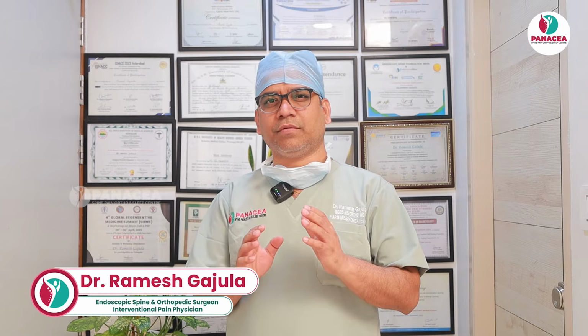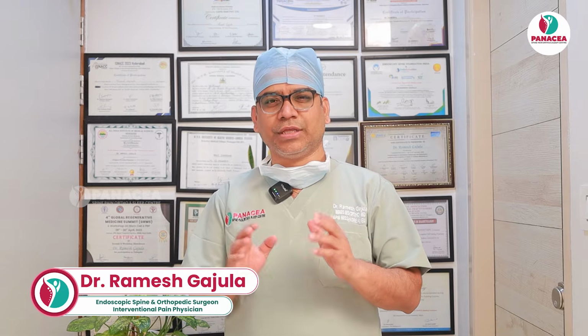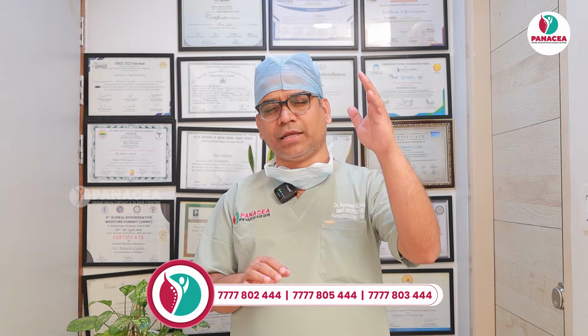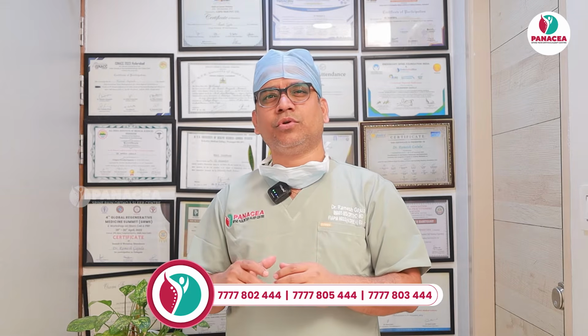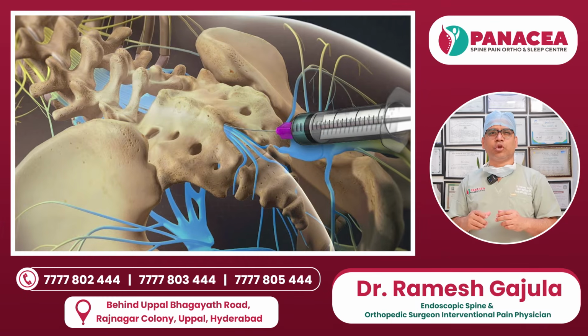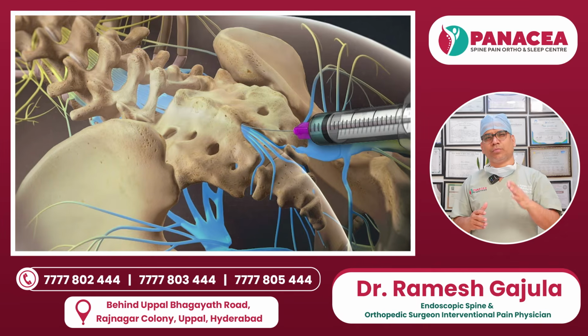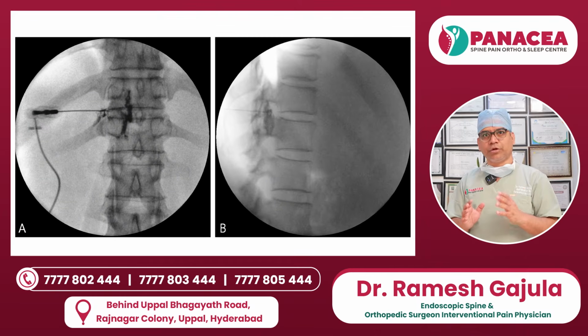It all started with caudal epidurals long back, when fluoroscopy was not there. The landmarks were palpated and people used to do caudal epidurals, though the pathology was somewhere higher up at L4, L5, S1. In those cases we used to give huge volumes of steroid mixed with local anesthetics, and we were not sure whether this drug would go up to the anterior epidural space at the exact site of pathology. But of late, fluoroscopy has come into the picture.